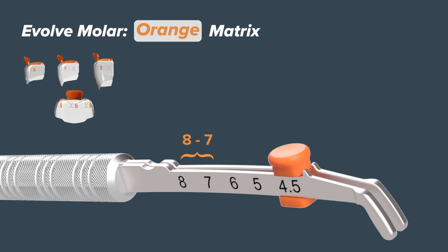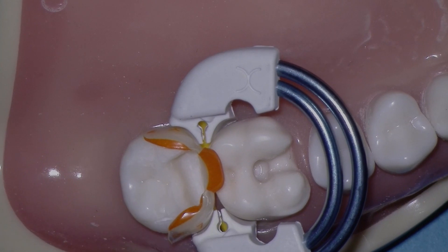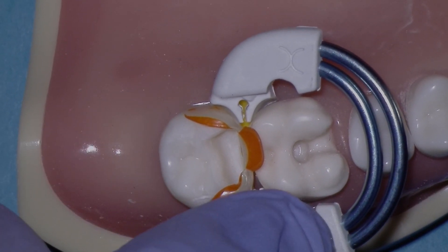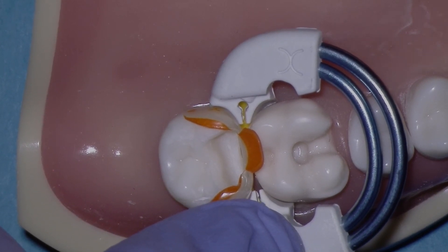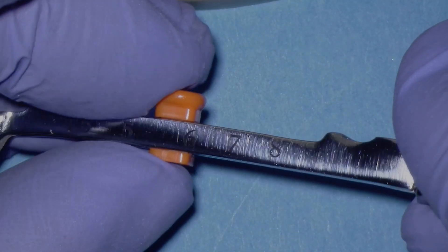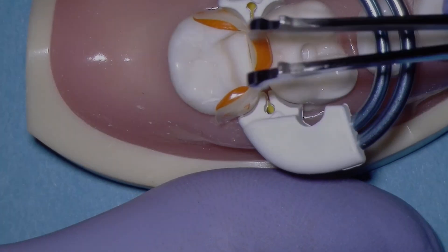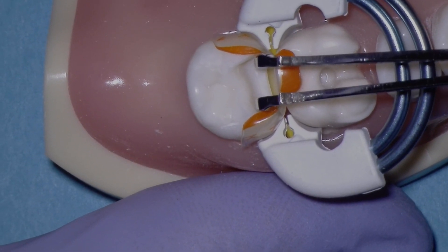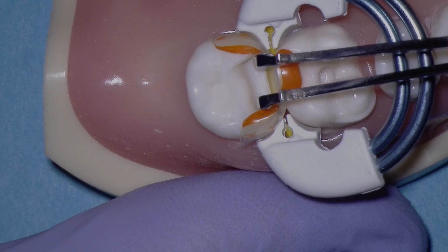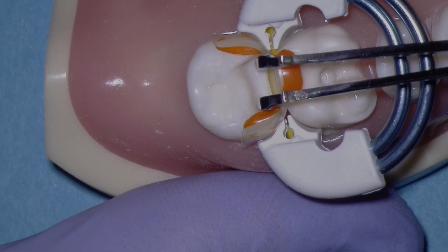Let's take another look at the adjustable end of the push-pull instrument when we're using the orange evolve molar matrix. The orange evolve matrix is for large, wide molars, which is very common in the maxillary arch, especially between the maxillary first and second molars. Let's move the slider button up to about seven and a quarter and see how that works. The orange evolve matrix is much broader and flatter than the blue evolve matrix, and this is for broad contacts and broad teeth just like this one. That is a beautiful wide contact and perfectly appropriate for a wide tooth.